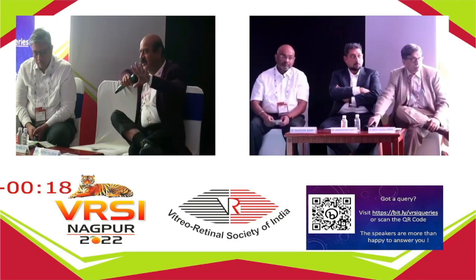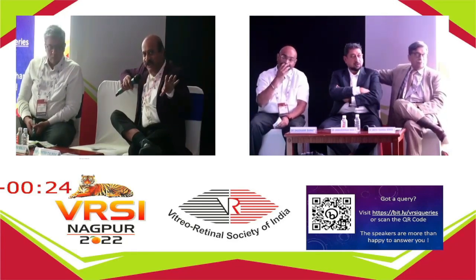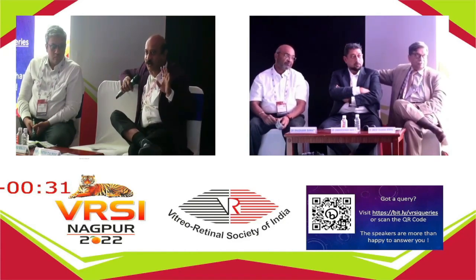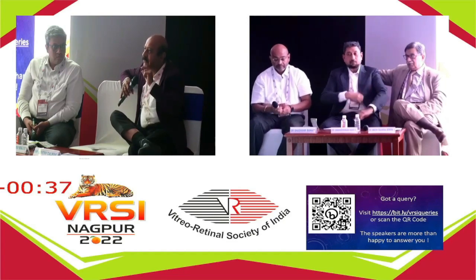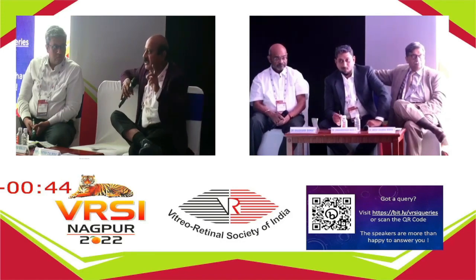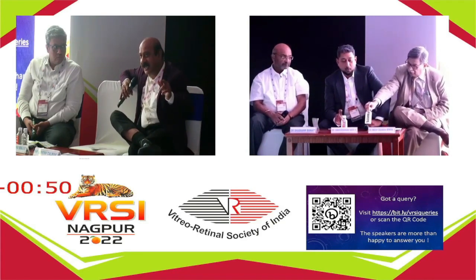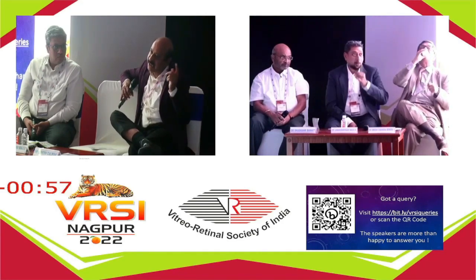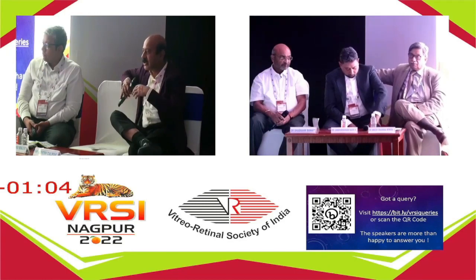Yeah, this particular topic actually highlights having both the modalities in place. Either OCT with FA is not going to get replaced by OCTA. So here it's very clearly coming out that we need to have both the modalities for the future. When you are evaluating the superficial lesion, especially when it involves physiology, probably OCT and FA score higher. When you are evaluating the deeper lesions and when there is a structural predominance, OCTA scores high over OCT and FA. So it's not clear that either of these is superior and you can do anything with it.